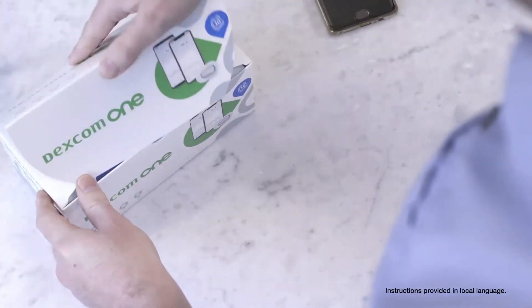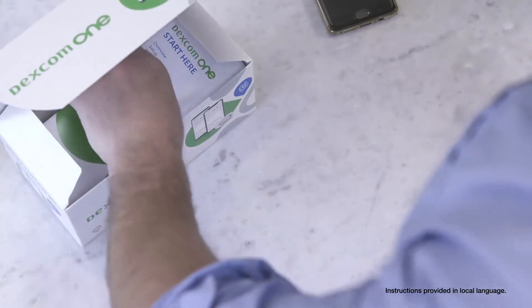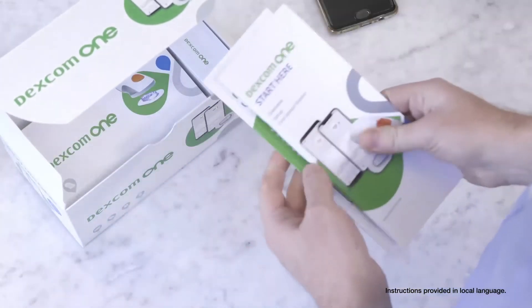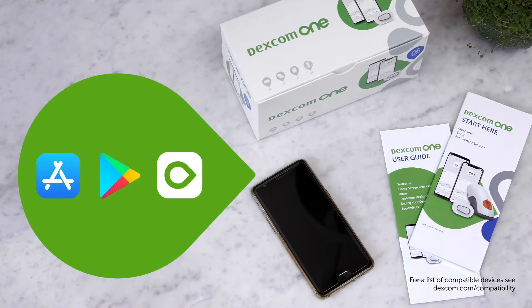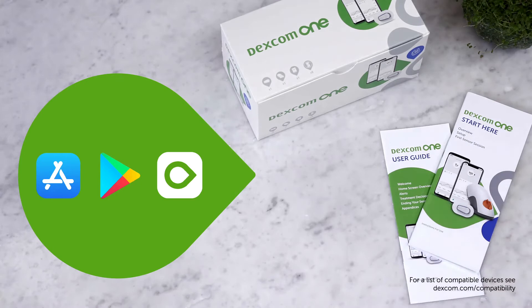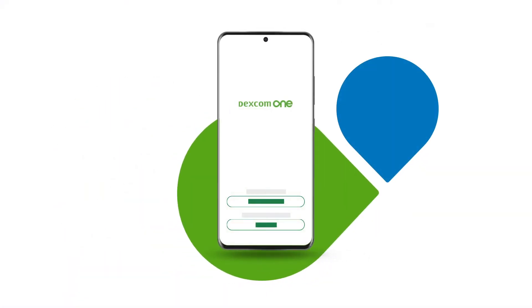Now let's show you how to get started. The Dexcom One box contains a sensor, transmitter, and your instructions for use. The first thing you need to do is download the Dexcom One app. Then either log in, or if you have never had an account with Dexcom, create an account first.